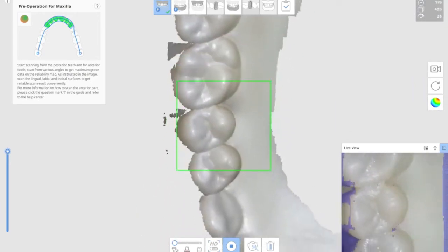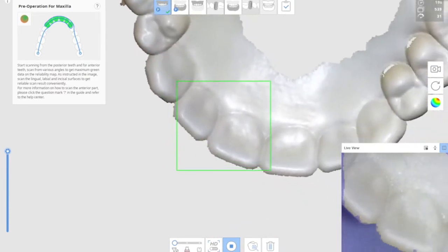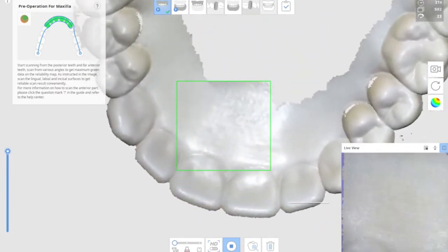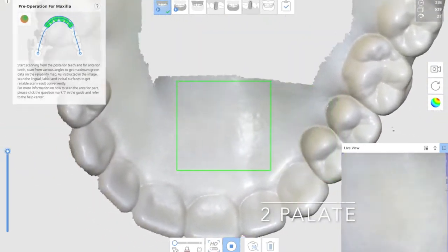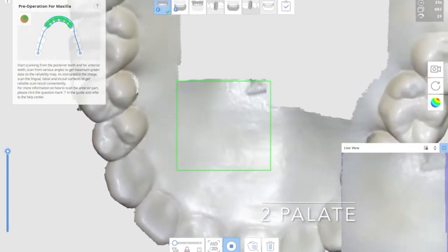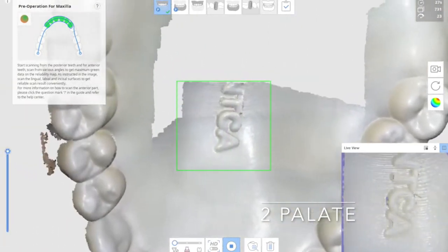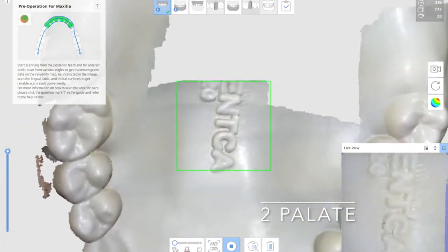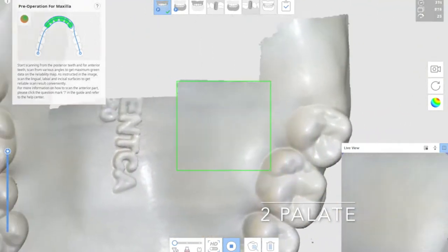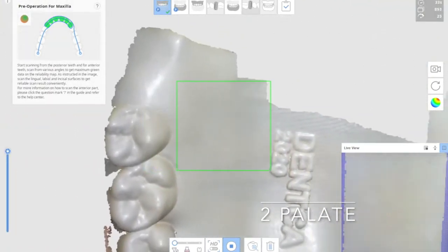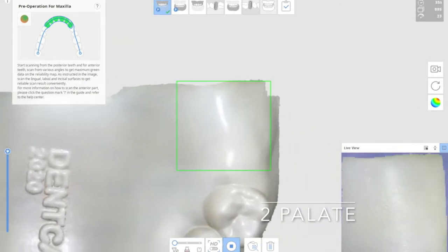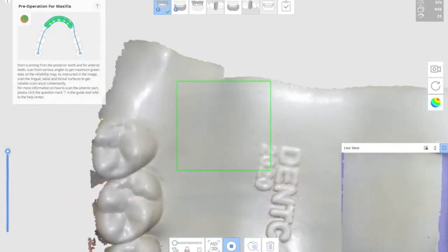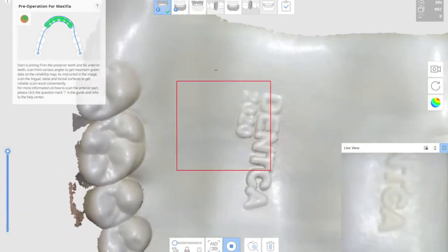Then scanning the palate. Again, the same zigzag motion as you've seen. So slowly move right and left to cover the entire palate.